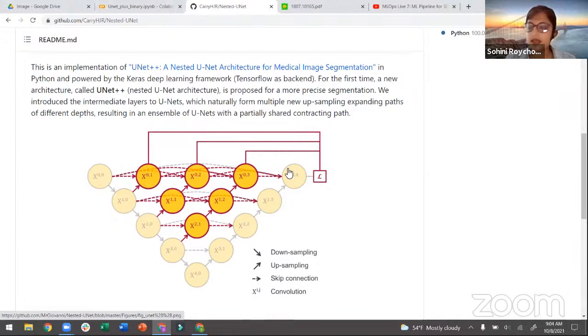So you upsample and again take it back to the same size as the original image size. But what you also do is all the intermediate upsampled images, you actually put them together. So the same size downsampled image and the same sized upsampled images are actually combined together, concatenated. And it has been shown that this concatenation helps the CNN to better distinguish background from foreground images. So that's the reason why these are just concatenations or skip connections, essentially, where you are combining these intermediate layers.